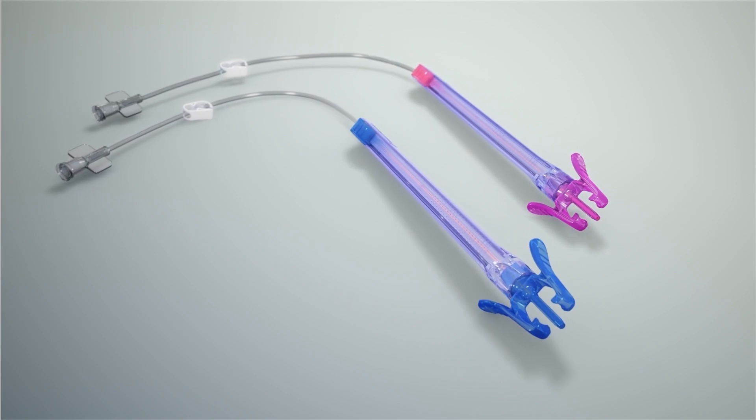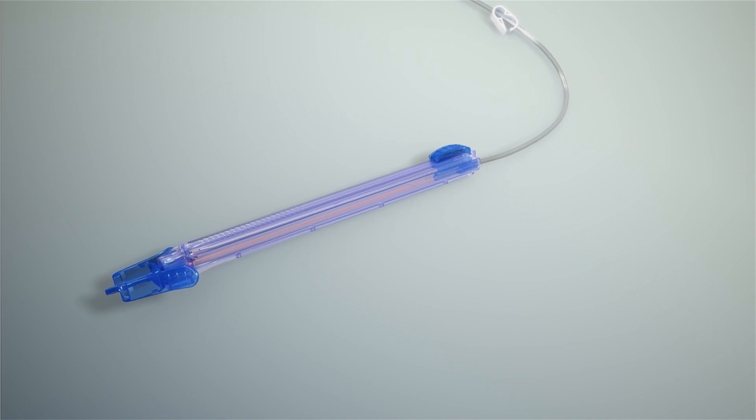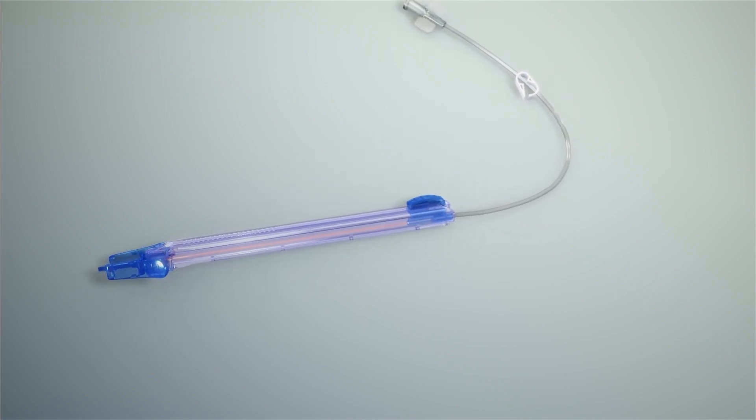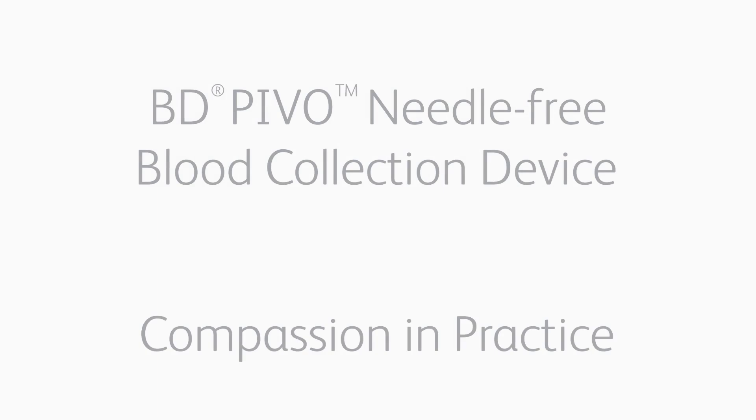High-quality blood collection from indwelling peripheral IV catheters is now possible, creating a virtually pain-free patient experience. PIVO is compassion in practice.